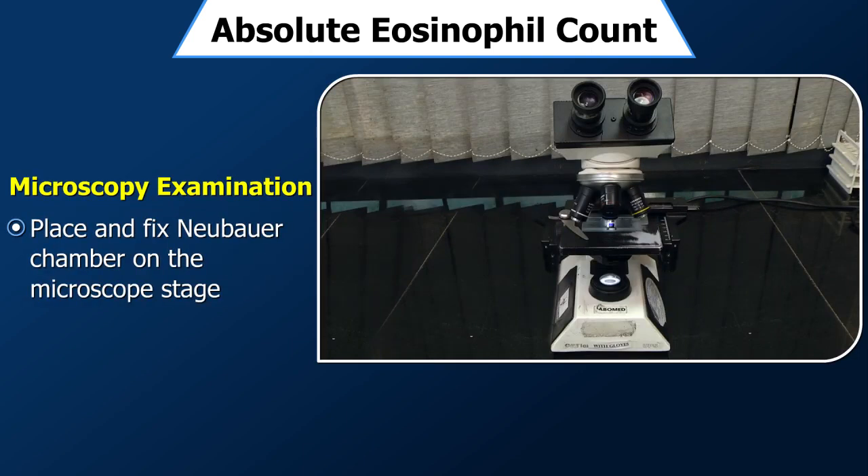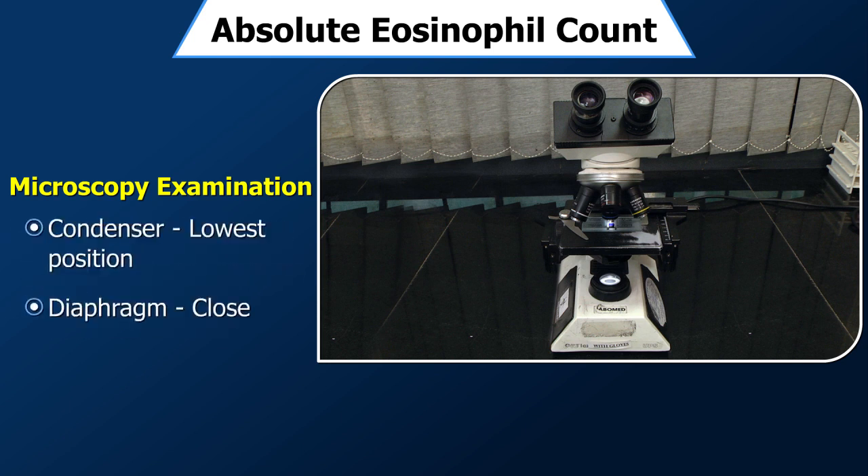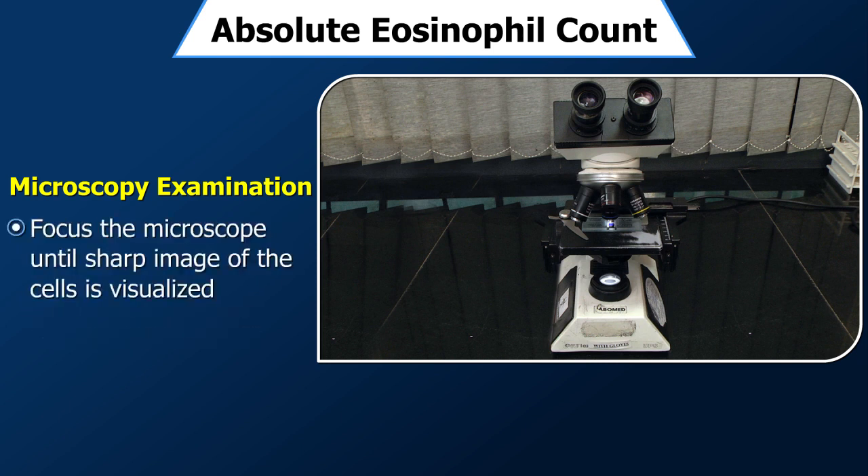Microscopic examination: Set the microscope and focus. Place the Neubauer chamber on the microscope stage and fix it with the clamp if available. Turn on the microscope light. Place the condenser at the lowest position and close the diaphragm. Focus the microscope until you can see a sharp image of the cells through the eyepiece, adjusting the stage accordingly.